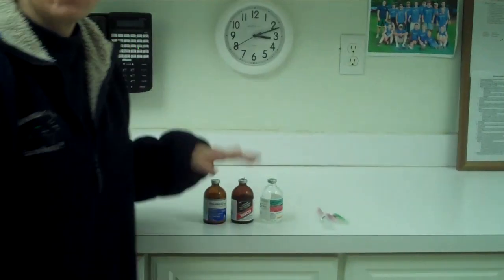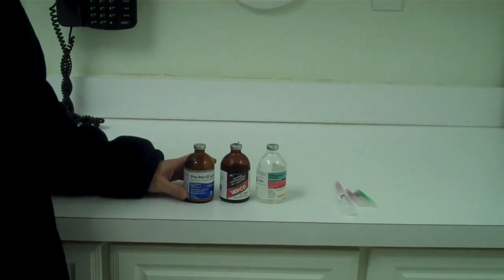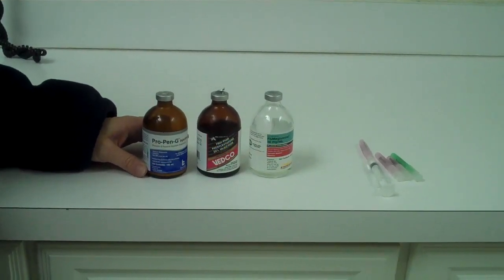Hi, I'm Dr. Wynne Degrassi from Mountain View Equine Hospital, and today I'm going to talk to you about how to give an intramuscular shot to your horse. First off, you need to know what kind of medication you're going to give, because that's going to determine the size of syringe as well as the size of needle.